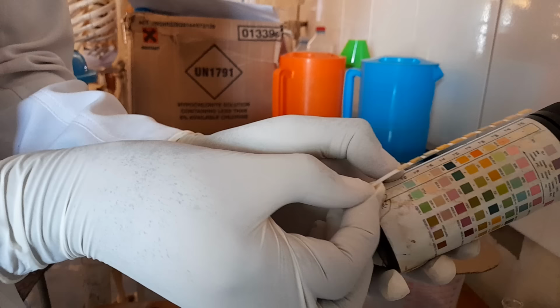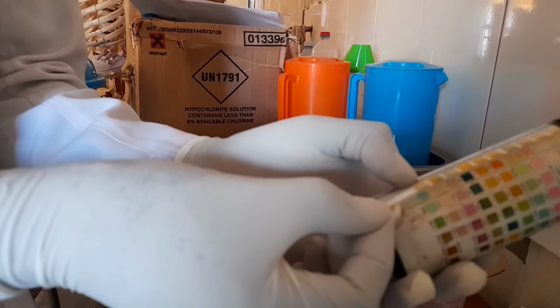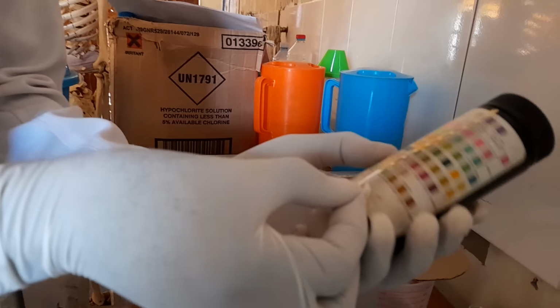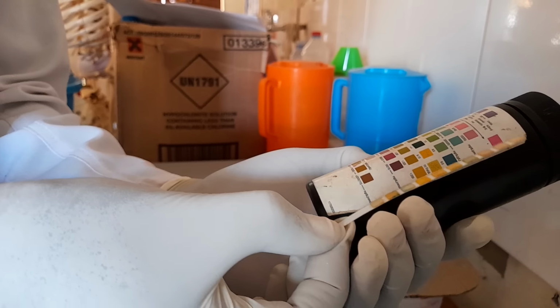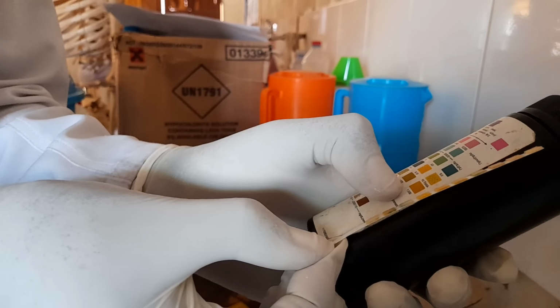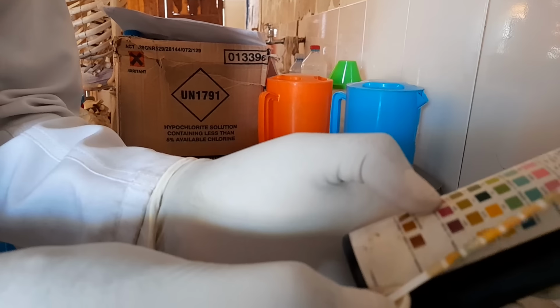Then bilirubin, it has gone to plus. Then ketones, we'll say it hasn't changed. Then specific gravity, so you keep moving. This is for specific gravity. So you keep moving it until you find the color. So specific gravity at this moment is this color, which is 1.030, which is 1030.